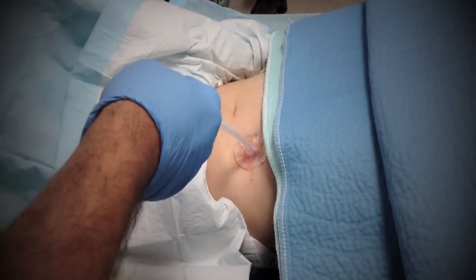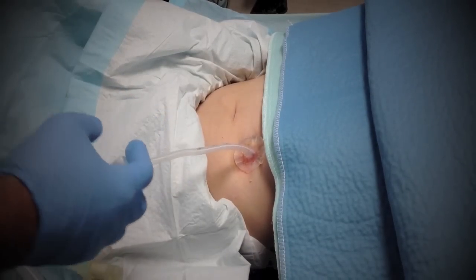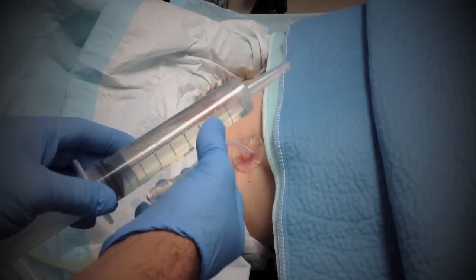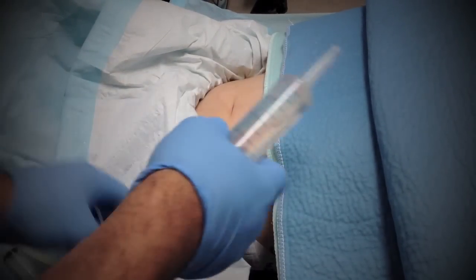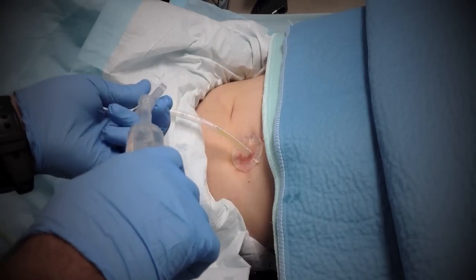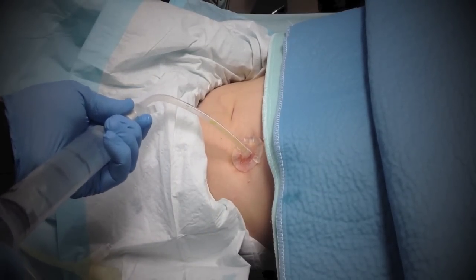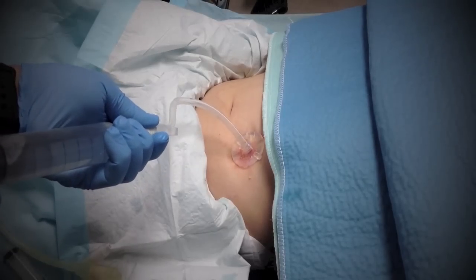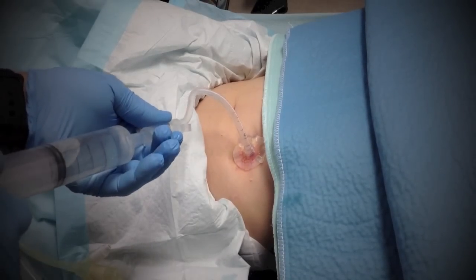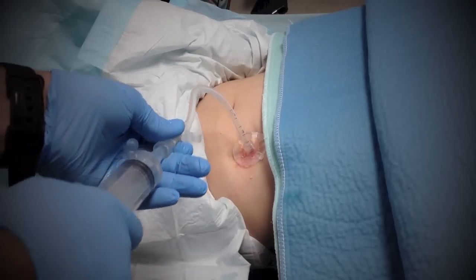Now we're going to have the x-ray people come in and inject the gastrograffin. This is fluid with gastrograffin — a radio-dense material for when we do the x-ray. One thing we should do is aspirate first; there's gastric contents coming through the tube. Then we go ahead and push. When we do the x-ray, it's just going to show that the tube is in the right place.